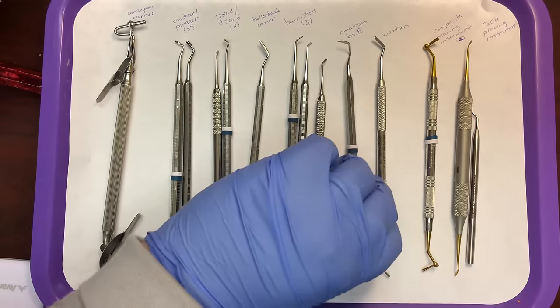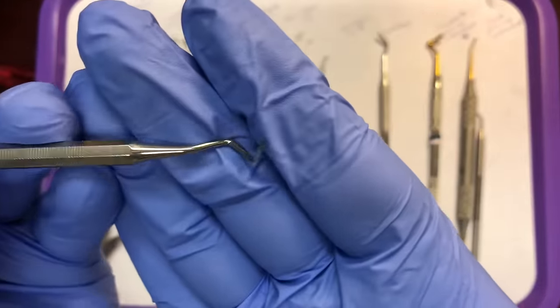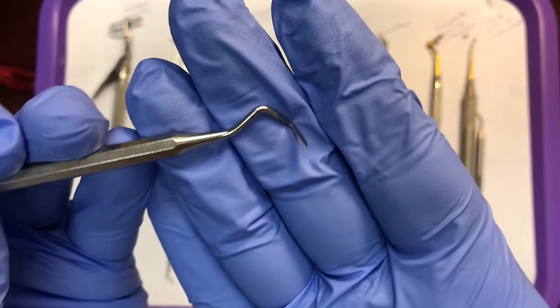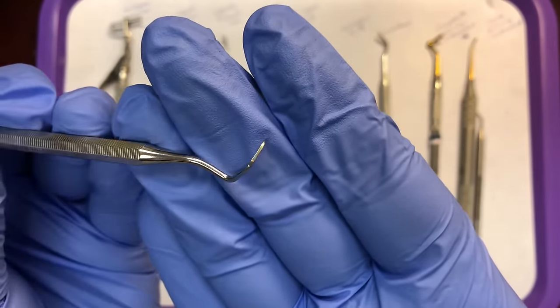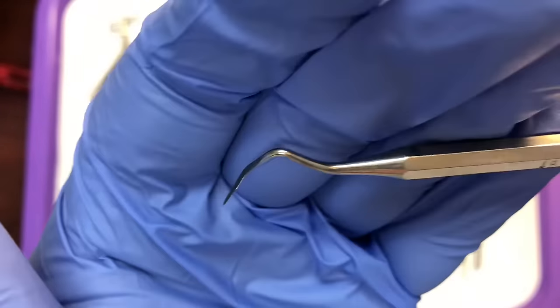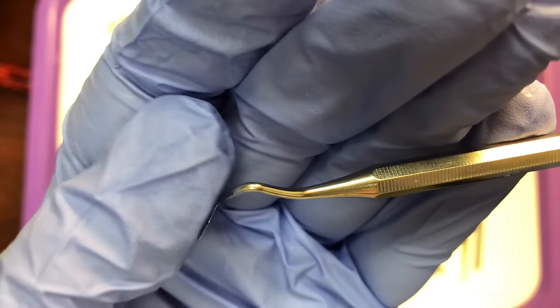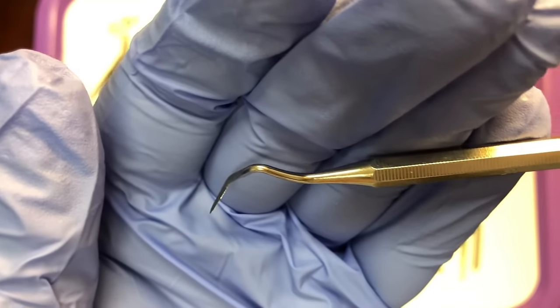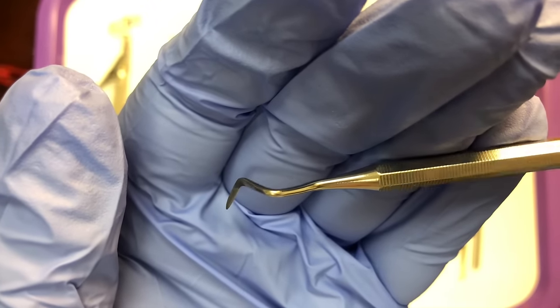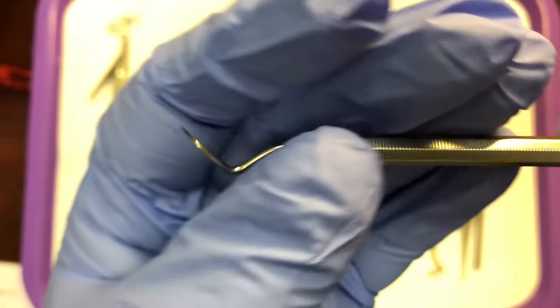Once the amalgam hardens, there may be some overhang. If the mesial and distal sides are not smooth and the doctor needs to scrape away any excess, they would use an amalgam knife. The amalgam knife is very sharp and is used against the hardened amalgam to break off any overhang.